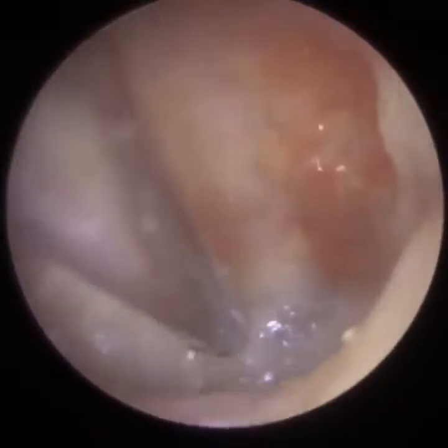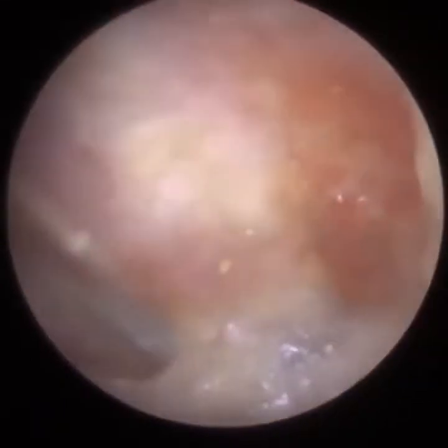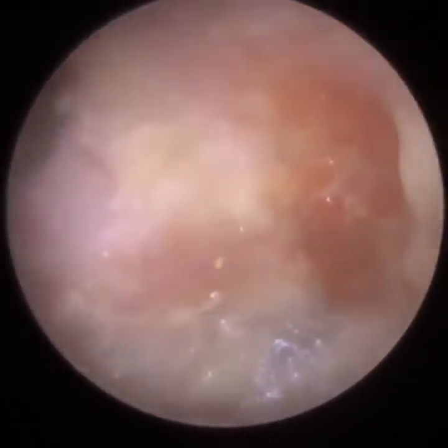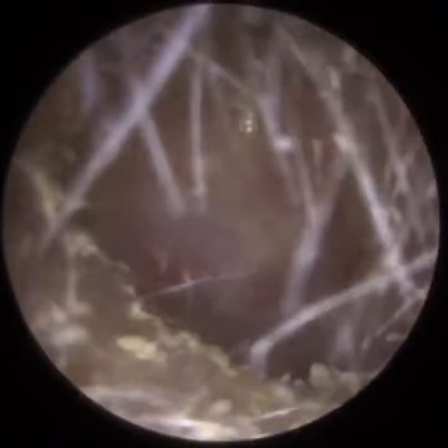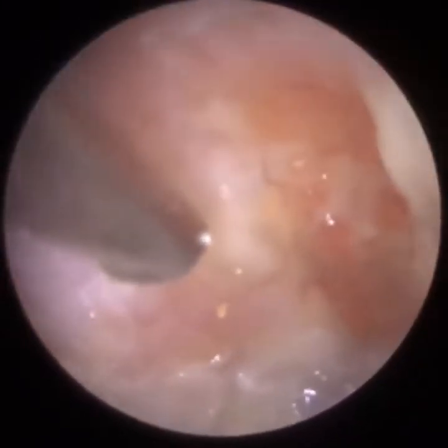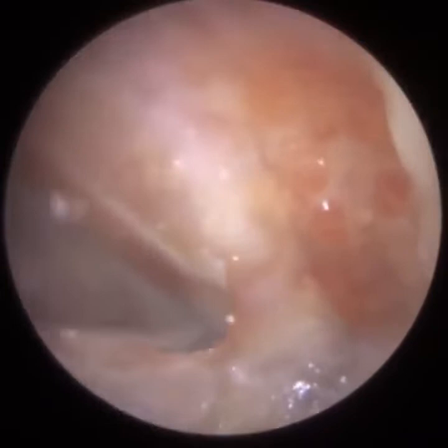Again, we're just on the anterior part of the eardrum because it's a bit damp there. You can see all that granulation tissue to the right, to the back part of the eardrum. You just see here the view we're getting. It's a really magnified, zoomed in view. And although it's zoomed in, we can still see the whole eardrum in one shot. Again, just placing the suction probe onto the eardrum, trying to peel the skin downwards.